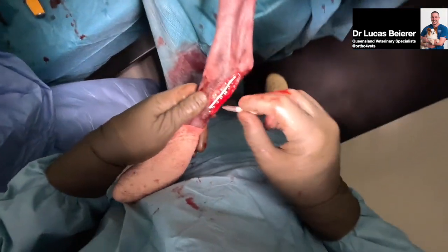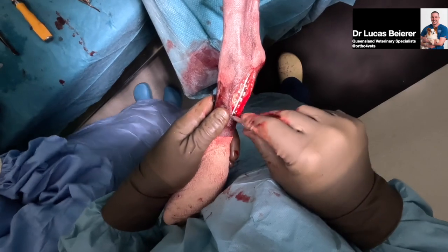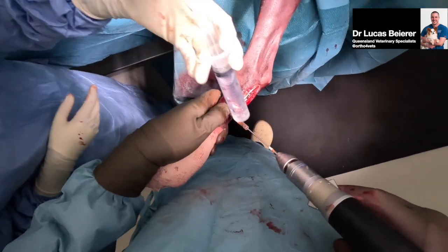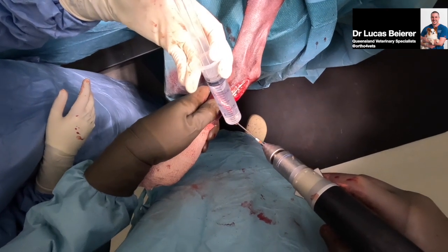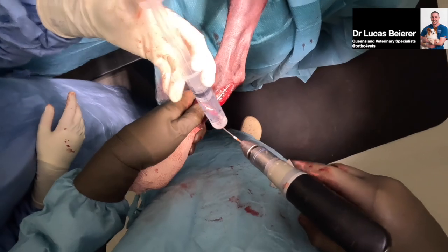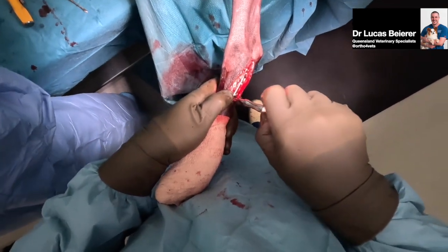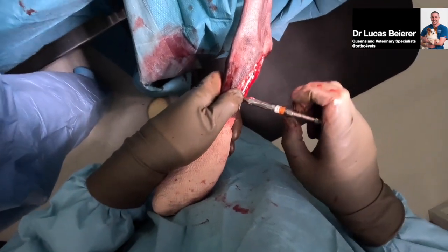Put another locking screw down in the metatarsal. Thank you. Seems like a lot. I just don't think you need to go across everything. I just don't think that's important.